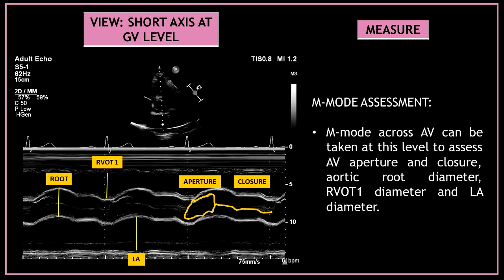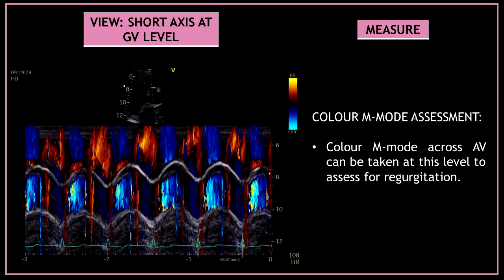M-mode across the aortic valve can be taken at this level to assess the aortic valve aperture and closure, the aortic root diameter, the right ventricular outflow tract diameter, and the left atrial diameter. You can also perform a color M-mode assessment across the aortic valve to assess for regurgitation.